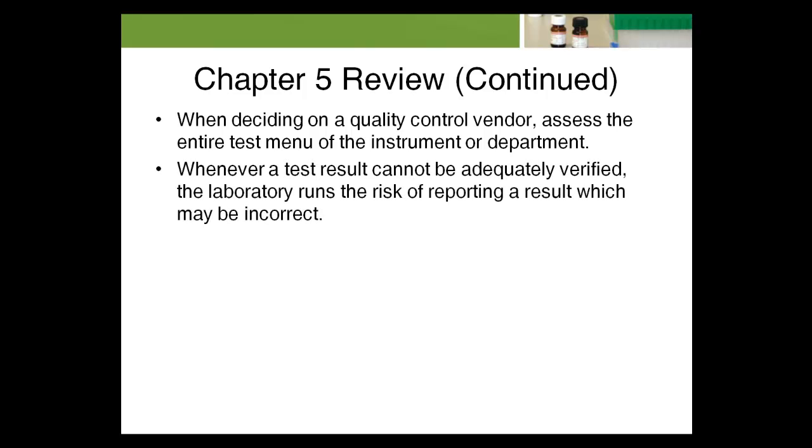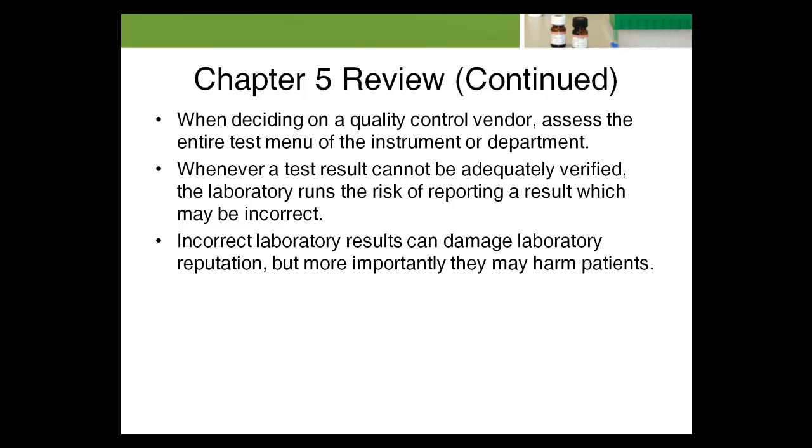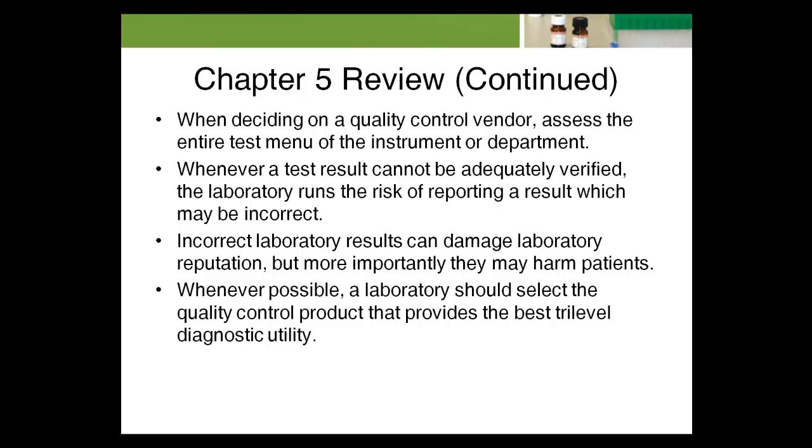Whenever a test result cannot be adequately verified, the laboratory runs the risk of reporting a result which may be incorrect. Incorrect laboratory results can damage laboratory reputation, but more importantly, they may harm patients. Whenever possible, a laboratory should select the quality control product that provides the best tri-level diagnostic utility.